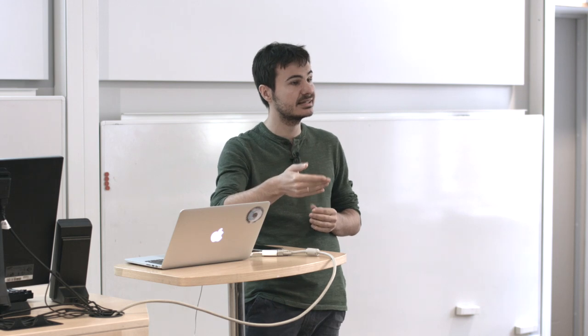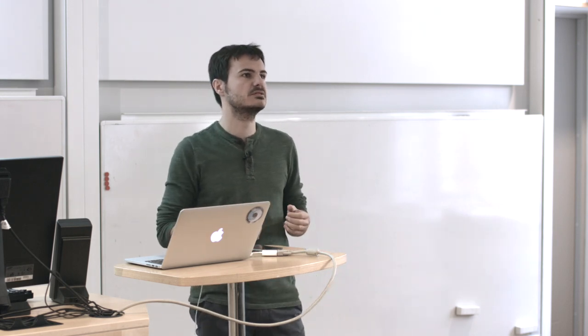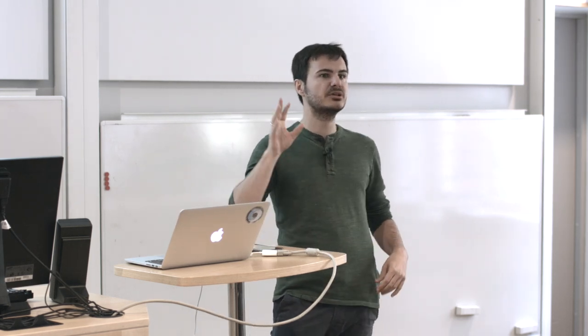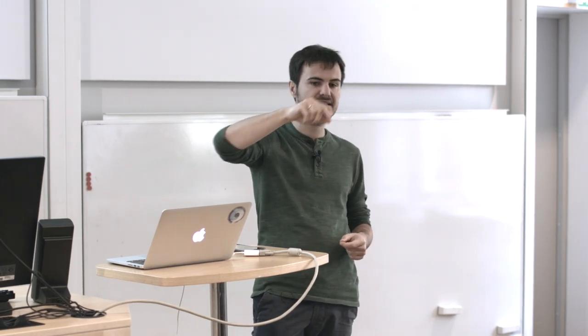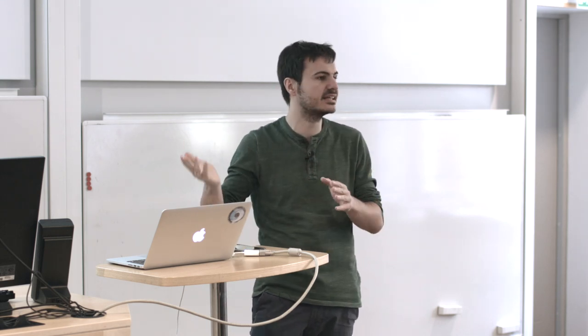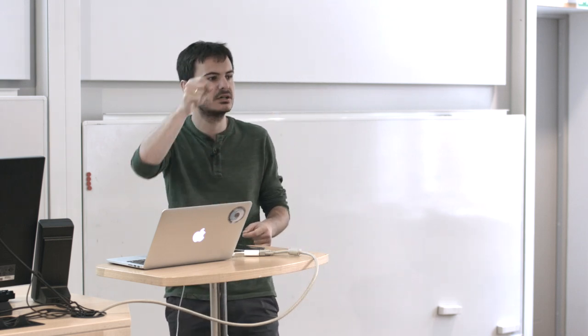the surface dice metric. What we wanted to measure is how long it takes for a radiographer to correct the segmentations that are provided by the model. If we use standard intersection over union or dice scores, the thing is that if the model predicts the center of the organ but does very badly on the borders, this is as bad for the radiographer as not predicting it at all, because at the end the radiographer has to go through the whole contour.